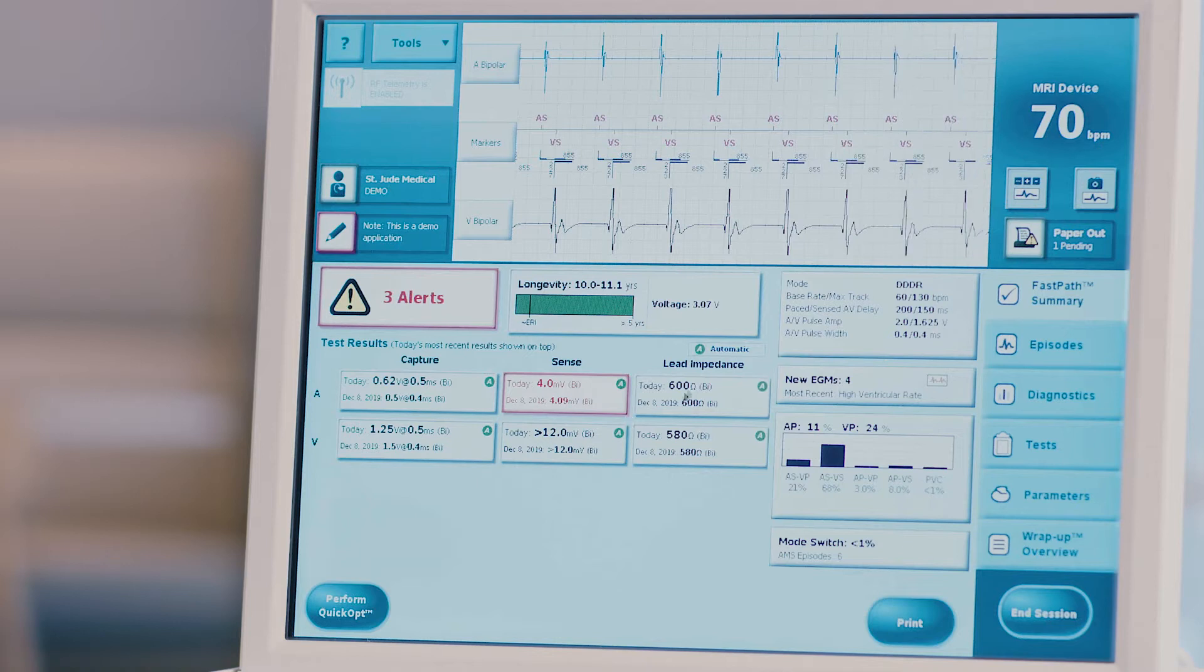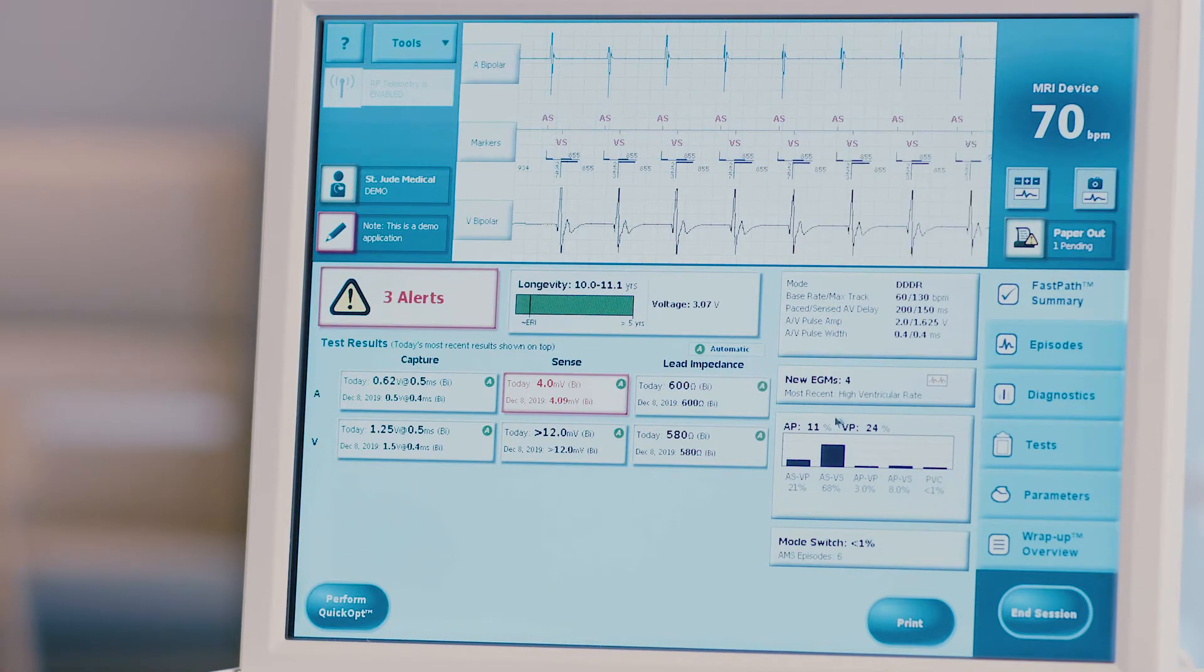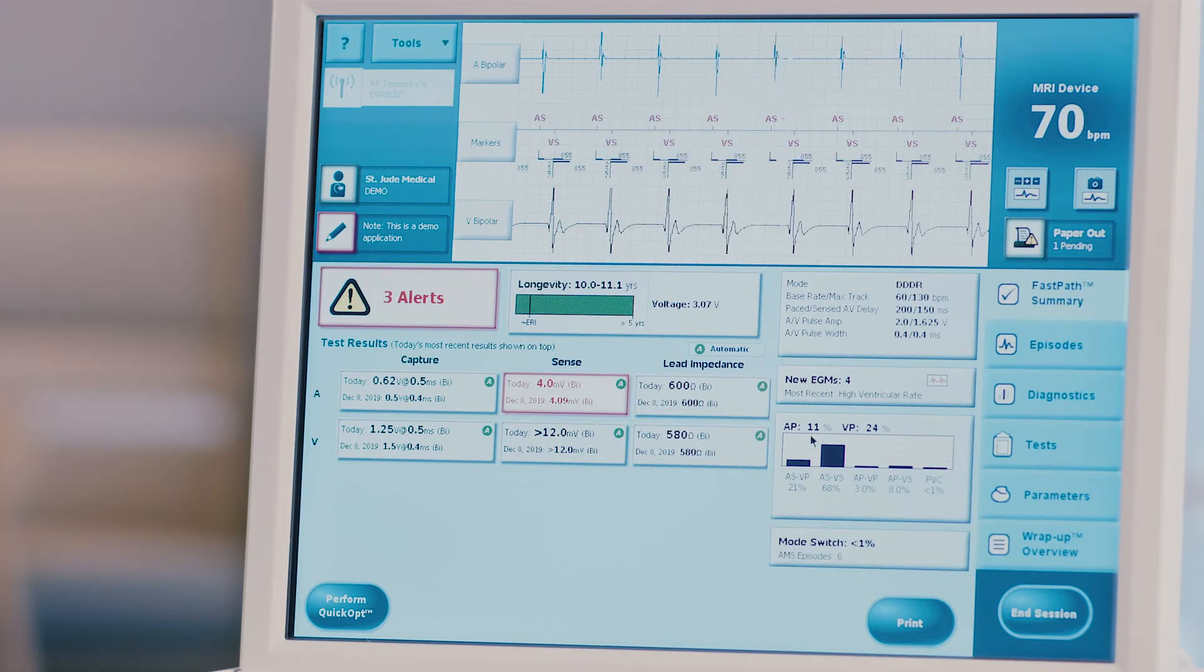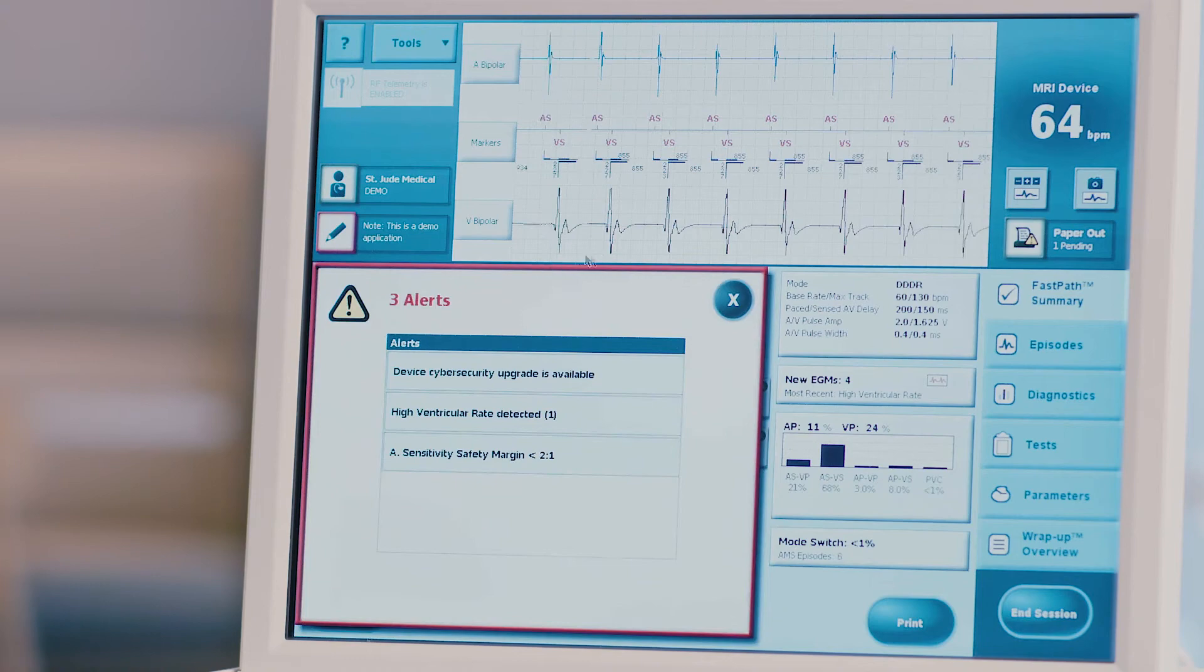Assess the program parameters including mode, base rate, and program pacing outputs. Assess pacing percentages and AMS, auto mode switch percentages, and episode counts. Assess alerts, if any, by clicking on the red alerts box on the left-hand side of the screen.